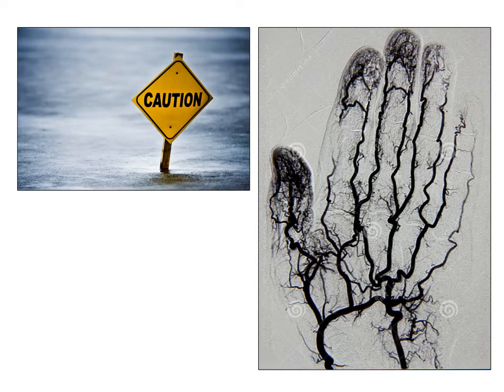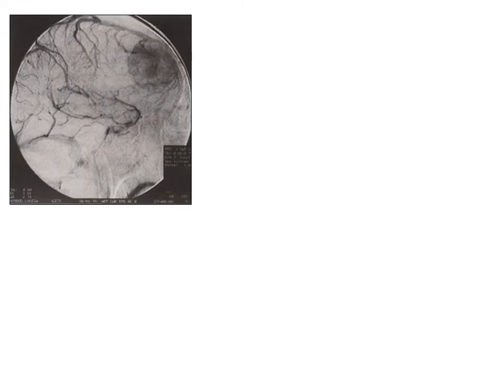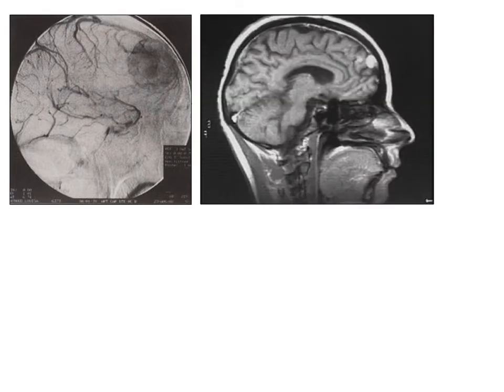So to conclude with this chapter on vessels, it is important to say that vascular semiology is less potent in diagnosis than pigmentary semiology. I make the comparison with the old times of neurosurgery when we made the diagnosis of brain tumors on the basis of arteriography. In that time, we had an indirect image of the tumor. Nowadays, we have MRI, and it's possible to better see the original tumor in the brain of the patient.